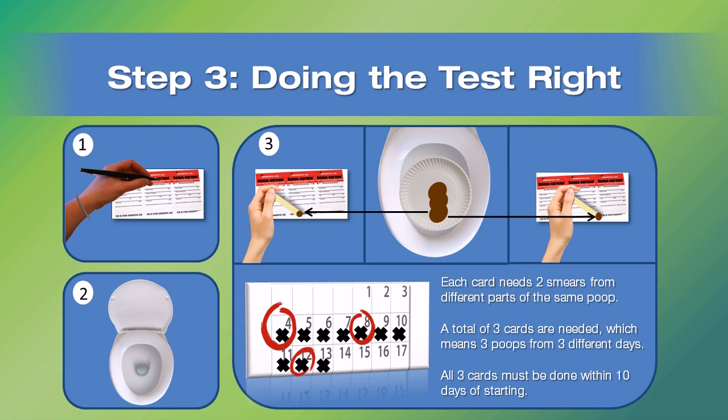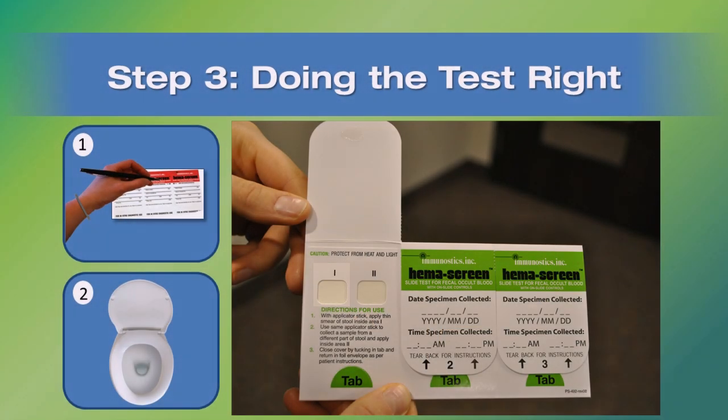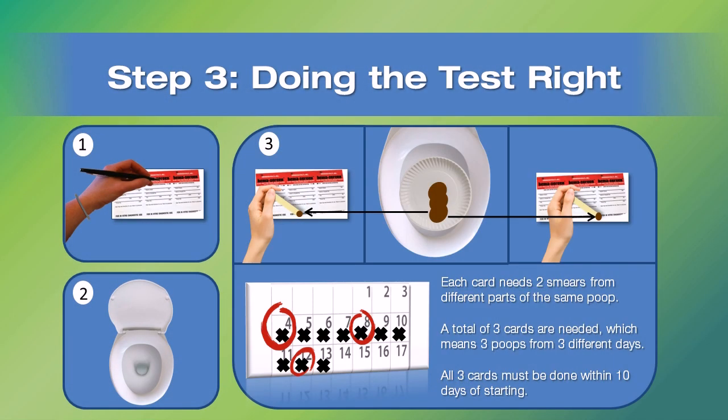The screen will absorb any blood if there is any. Smear this inside test flap area 1. Use the same scoop to scoop a second poop sample from the surface of a different part of your poop and smear it inside test flap area 2. Close the flap and put the card in the foil-lined envelope and keep it at room temperature. Throw out the stick and the disposable container, flush the toilet, and you're done. The first of 3 samples.